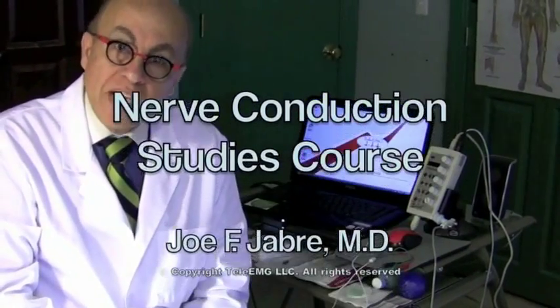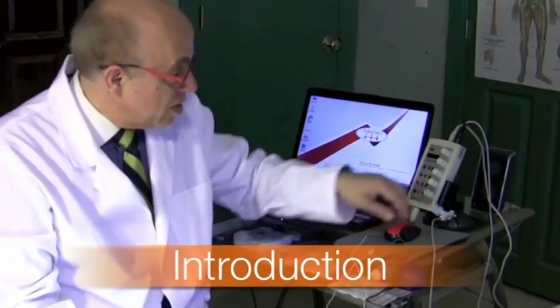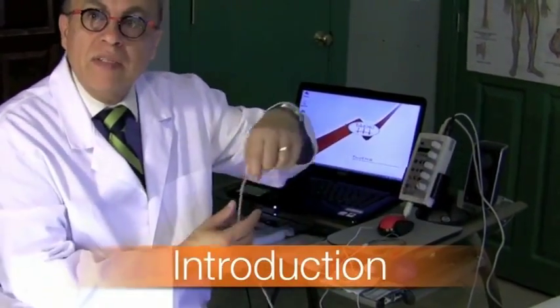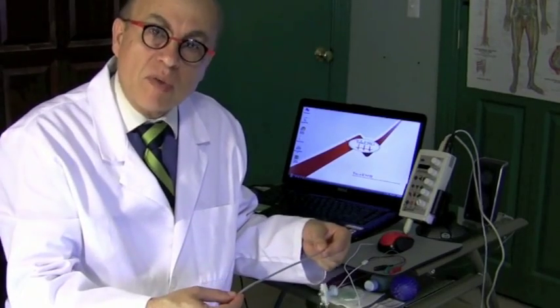I'm a neurologist and I specialize in EMG. EMG stands for electromyography, which loosely translated means electrical testing of nerves and muscles. The nerve is like an electrical wire. So basically the way we test it is the same way an electrician tests an electrical wire. We run electricity through it.